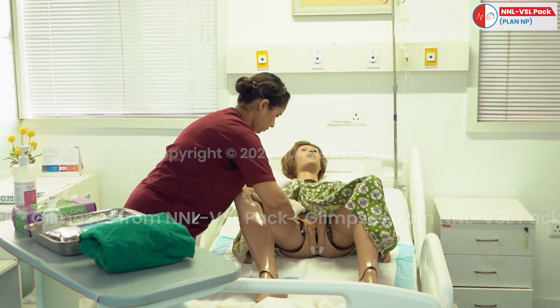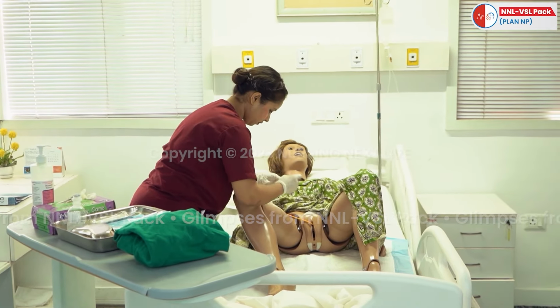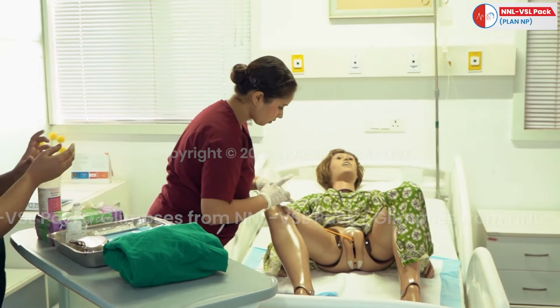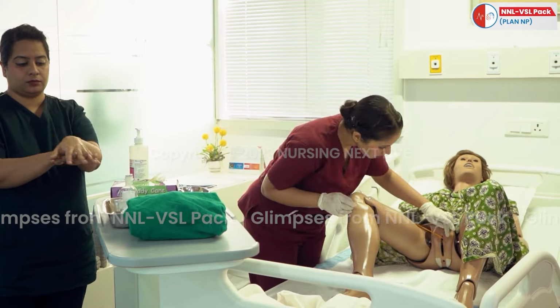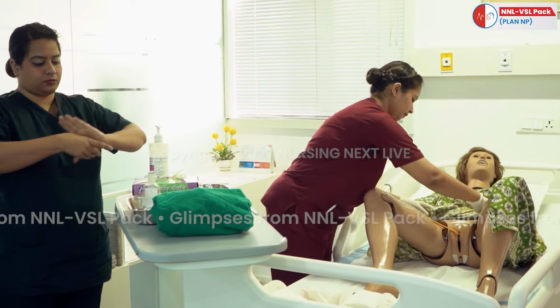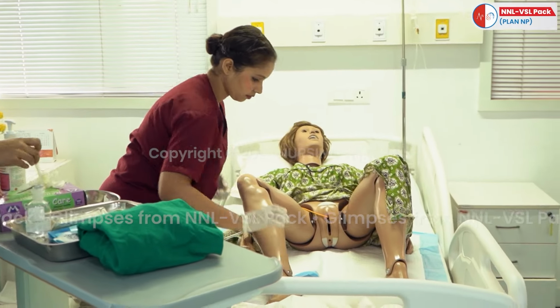Inspect the perineum for erythema, drainage, odor. Provide perineal hygiene if required. Remove the securing tape. Remove gloves and do hand rub.